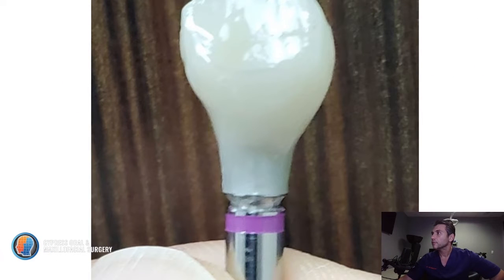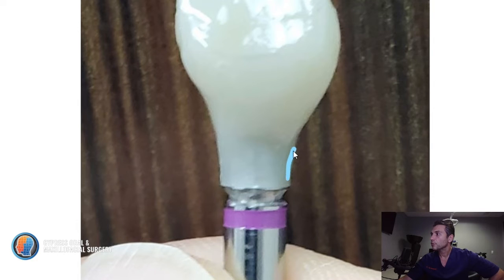We ended up making a temporary tooth for this gentleman, and this is what it looks like. And you see how nice and smooth the contours are. You know, the laboratory made him a restoration that literally looked like this, like that, simply because they didn't know what was going on under the soft tissue, and they didn't want to push too much on the soft tissue. So we want to give the laboratory a way to figure out what you want these things to look like.